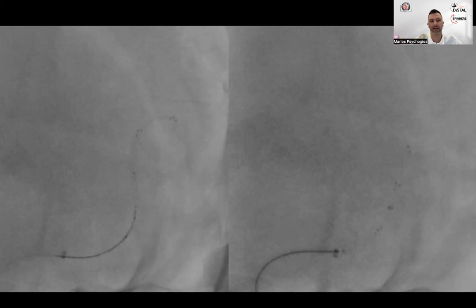If not, then you can do the blind mini pinning technique, which I will show you later, which is you take the long sheath, you take the aspiration catheter, you take your microcatheter, and then you place a stent retriever, and then you remove the microcatheter, sorry, and you advance blindly because you don't have the length on the stent retriever wire, but you advance blindly the 3 Max and go all the way to the clot and do a combined technique.